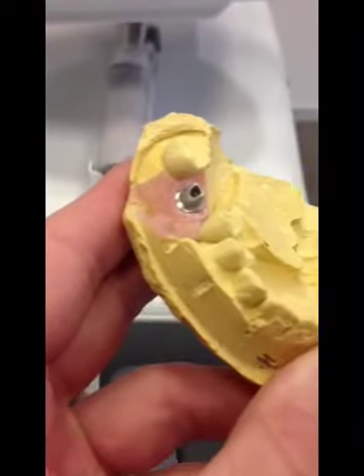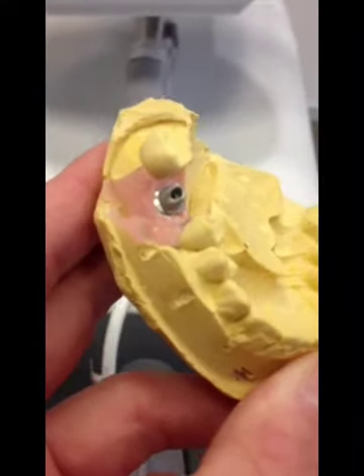Hey, this is Wes Wright here with Davis Dental, and I'm going to be showing you today how to restore an implant using your E4D Cad-Cam machine. And we're going to do a screw retained crown instead of a cement retained crown. I'm going to show you how to do that today, and it can end up saving you a good bit of money. It's also just fun.